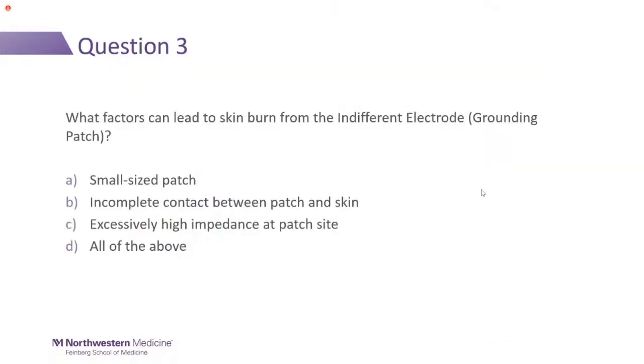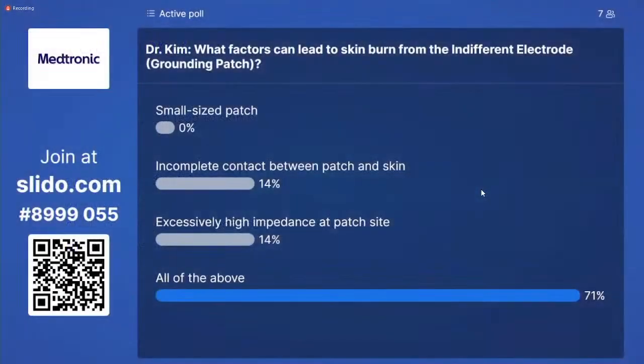Okay, question number 3. Which factors can lead to skin burn from the indifferent electrode grounding patch? Small size patch, incomplete contact, excessively high impedance, or all of the above?